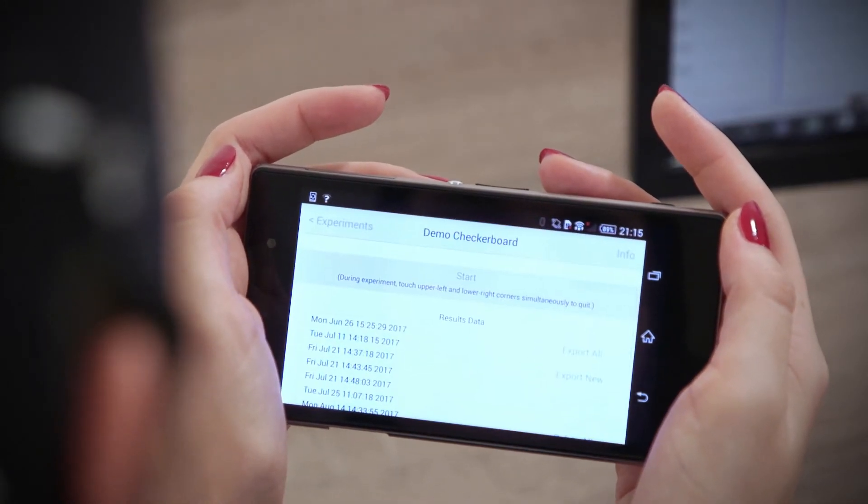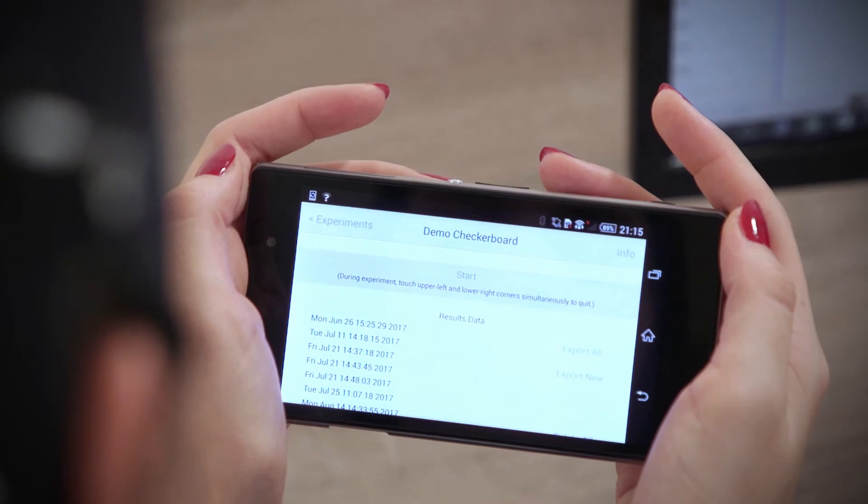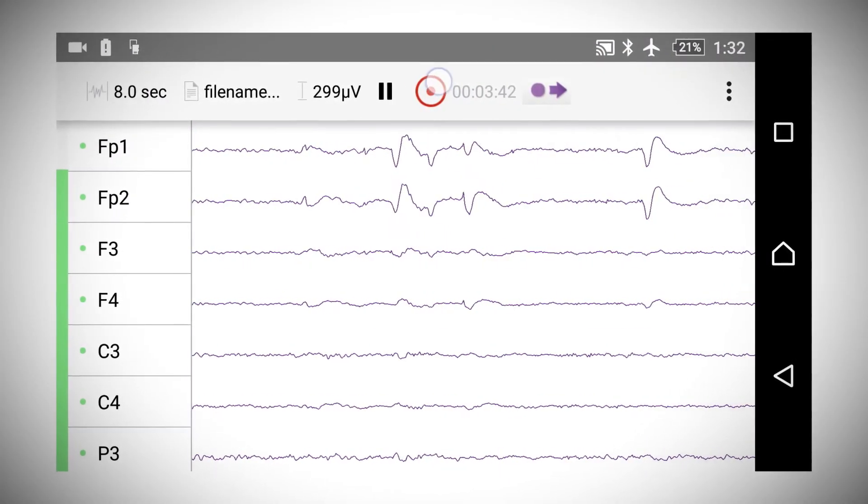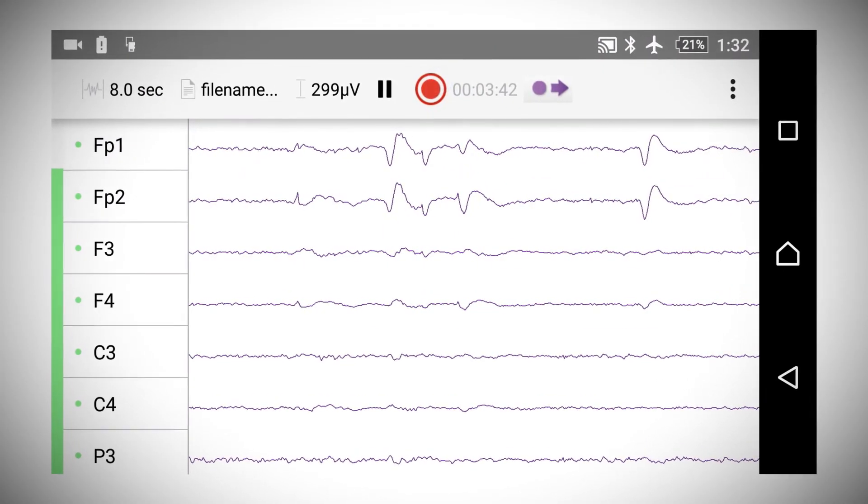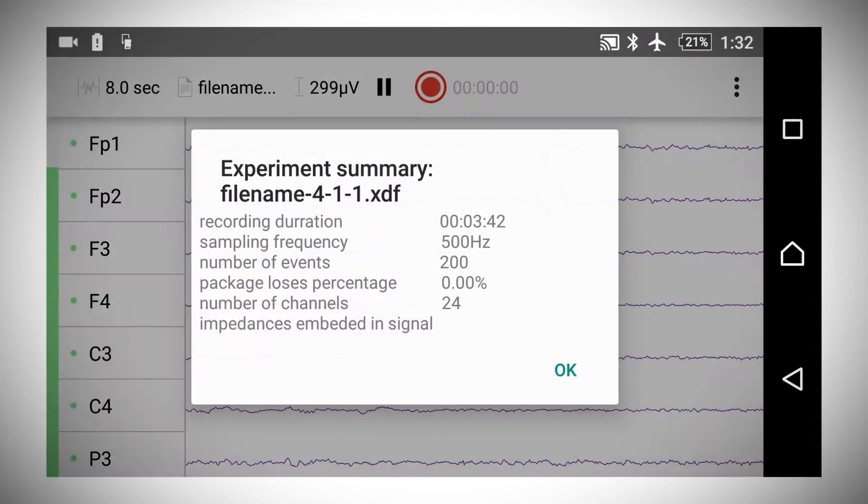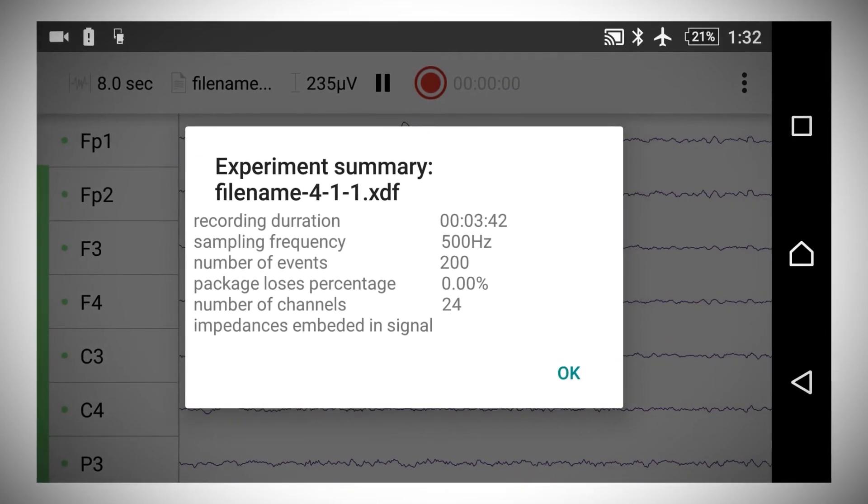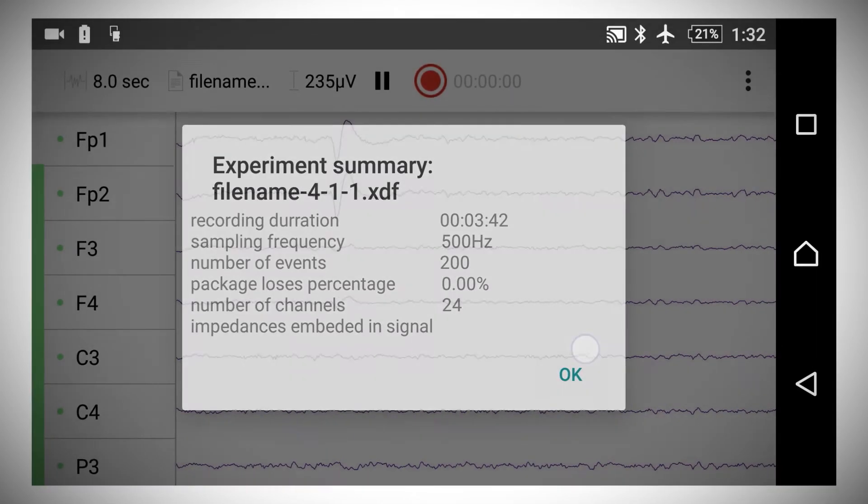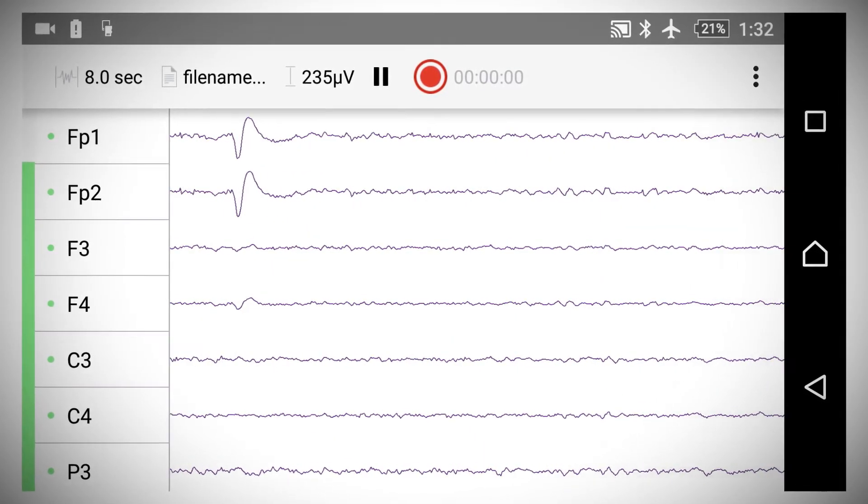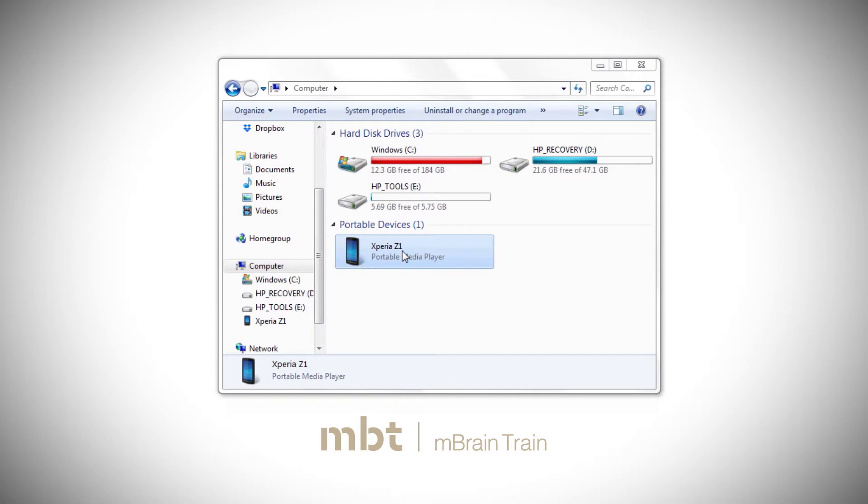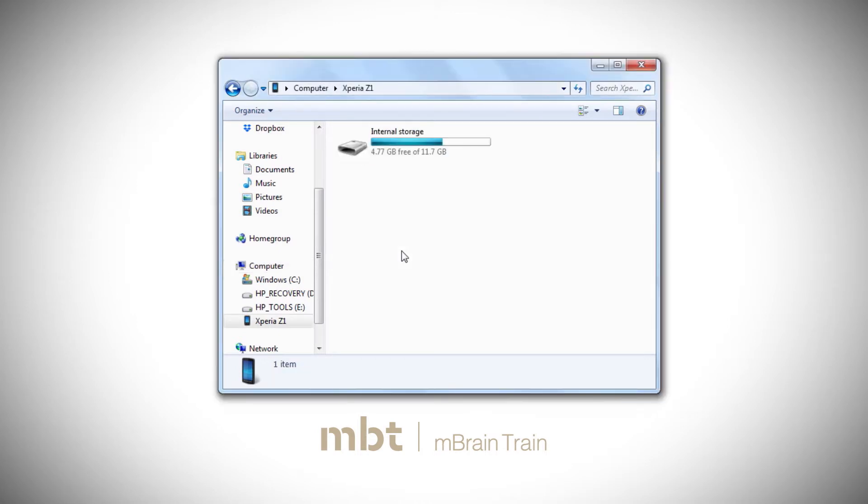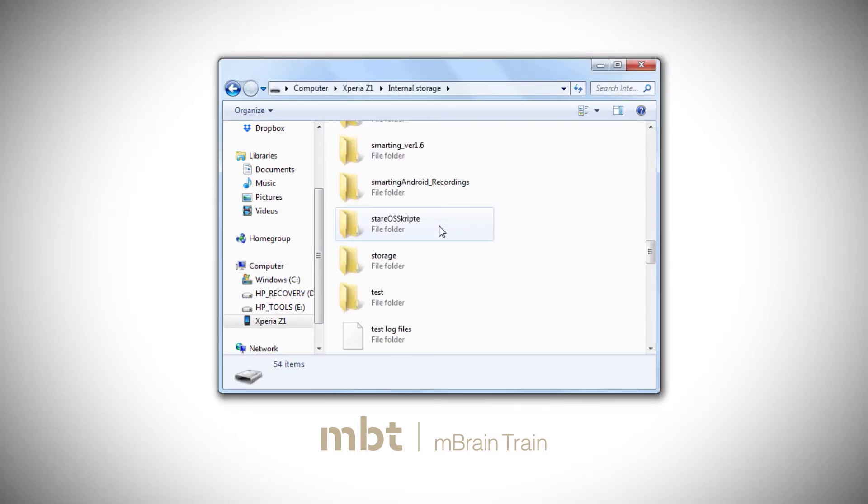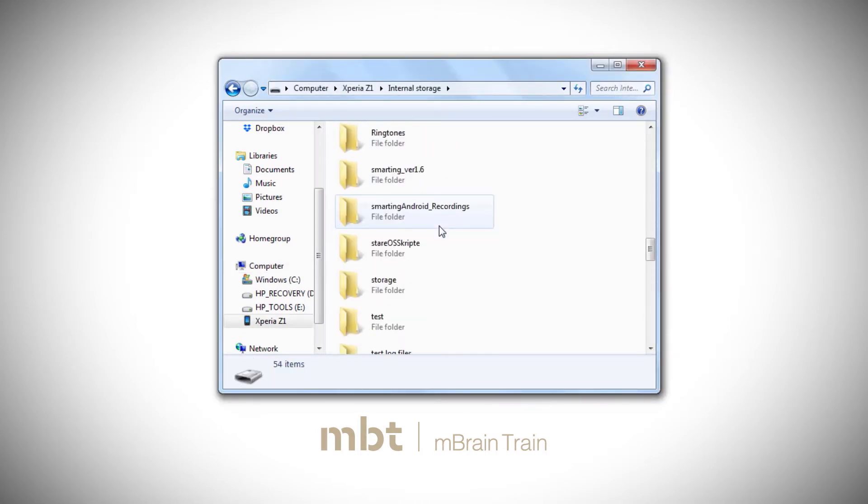At the end of the experiment, click the Record button in the Smarting app to end the recording and read the experiment summary. The number of events will be a good checking point for the experiment. The data from smartphone recordings will be stored in the Smarting folder in the smartphone's internal memory.